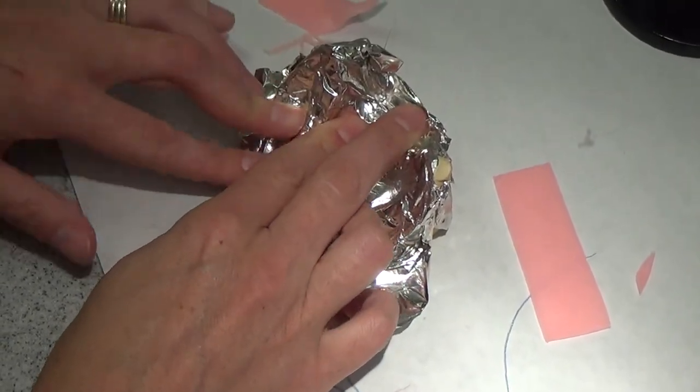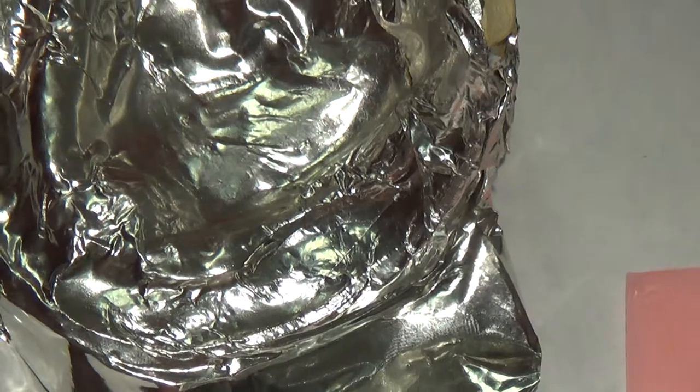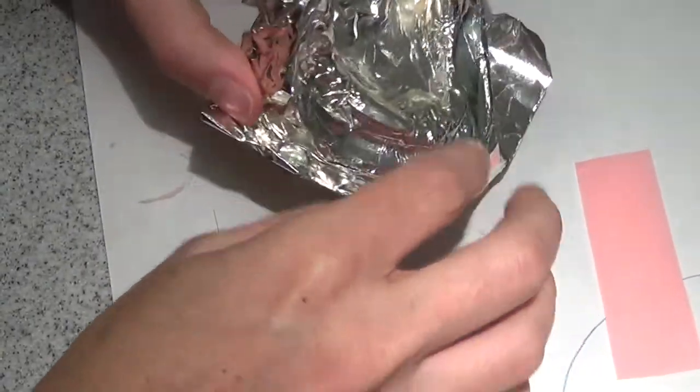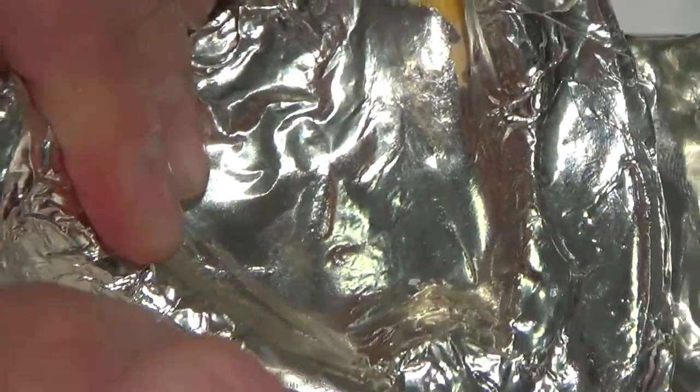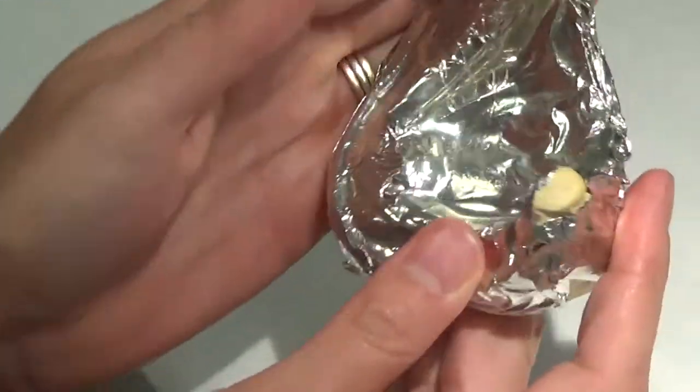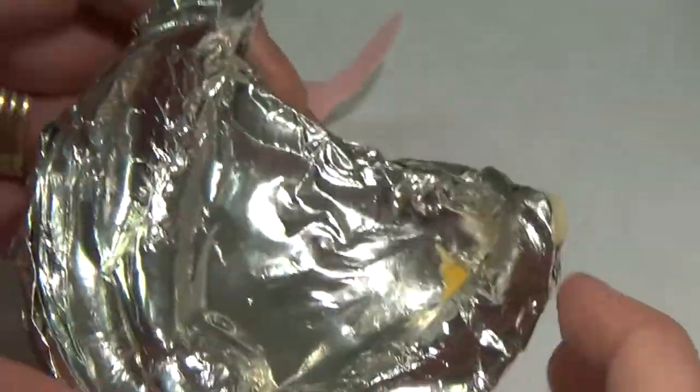The buccal shelf looks a little bit different than your tooth stops and the palate, because now I have no indication of how far out I need to go. That's why a land area is really beneficial — now I can see where the vestibule stops and I know how far out to go. I can't go past this point, and that's why a land area is good even in the primary phase. So you can see it's undercut here. I can block this out with wax, or I can just know not to push my tray all the way down into that area. I'm going to do it without blocking it out since I've done this before, but for you at this stage I would recommend blocking out that area — this side is pretty severely undercut and I don't want to break my tray.